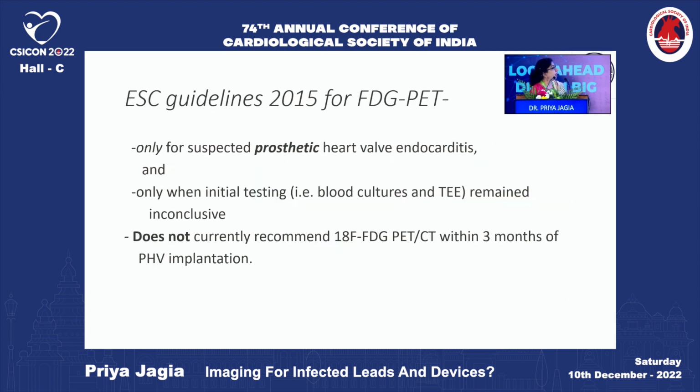So that is why the guidelines, the ESC guidelines for 2015, suggest using FDG PET only for suspected prosthetic valve endocarditis when the patient has had the valve placement later than 3 months earlier. So also it is useful only for suspected prosthetic valve endocarditis and only when initial testing remained inconclusive.